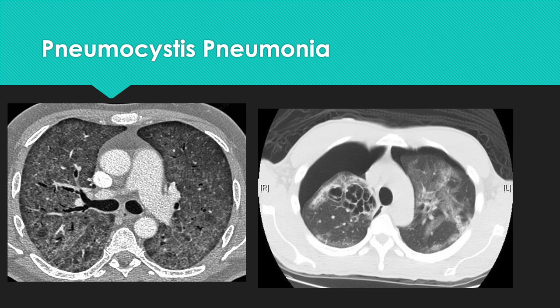Pneumocystis pneumonia presents with more aggressive and severe acute presentation. You will see a lot of ground-glass opacities along with cysts, and these cysts may be expanding pneumatoceles. A cyst seen at one point may form a large pneumatocele on follow-up. The cysts begin very tiny and thin-walled, and some may become thicker, forming pneumatoceles. You may have multiple or few, or multi-lobulated cysts. A cyst with ground-glass opacity in an immunocompromised patient makes Pneumocystis pneumonia a strong differential.